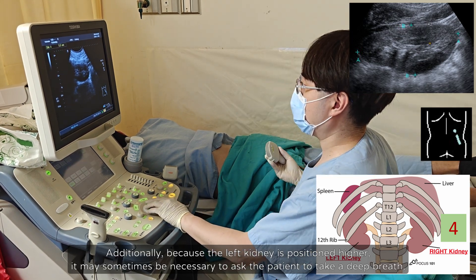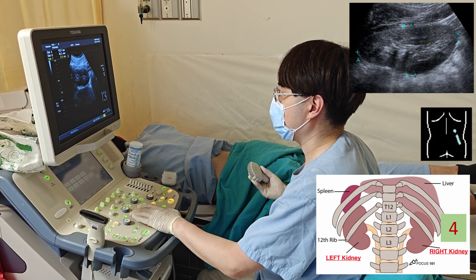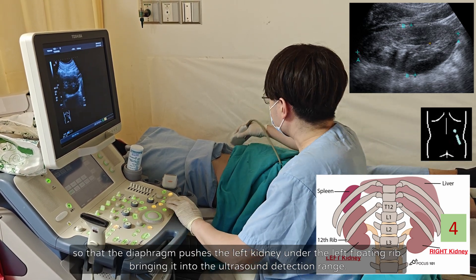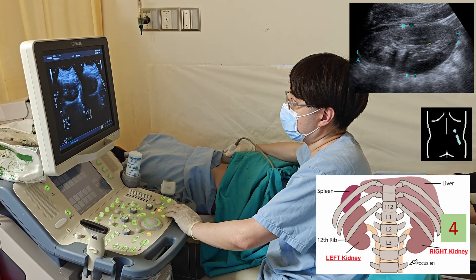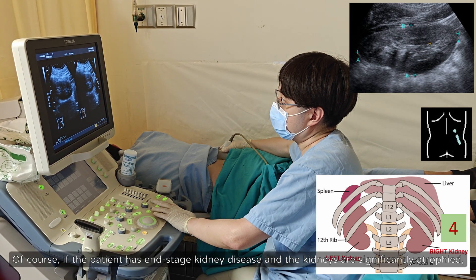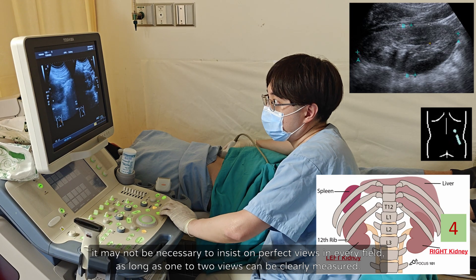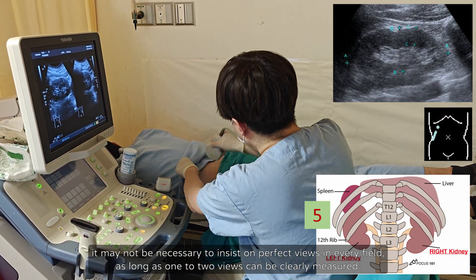Additionally, because the left kidney is positioned higher, it may sometimes be necessary to ask the patient to take a deep breath, so that the diaphragm pushes the left kidney under the left floating rib, bringing it into the ultrasound detection range. Of course, if the patient has end-stage kidney disease and the kidneys are significantly atrophied, it may not be necessary to insist on perfect views in every field, as long as one to two views can be clearly measured.